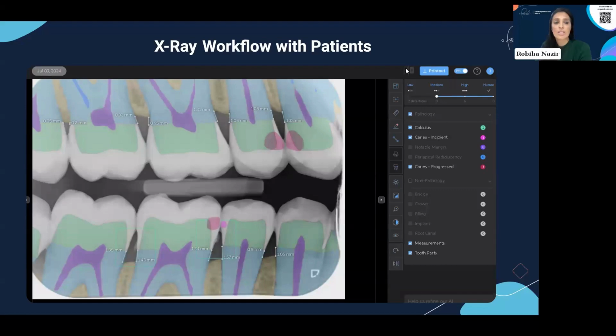So those X-rays don't necessarily need to be a year apart. Any X-rays. No, they could be any dates, and you'll be able to. Exactly. Yeah, so normally you can just have the left and right bitewing, or just to see a whole mouth if they wanted as well.